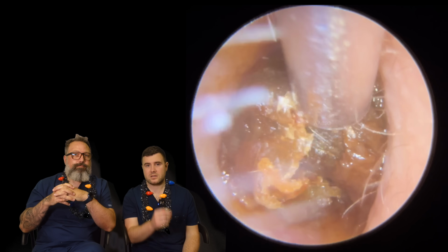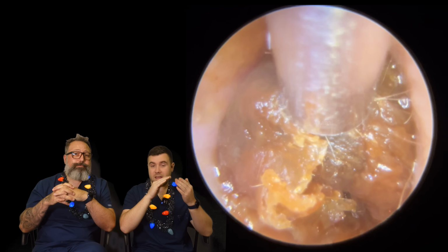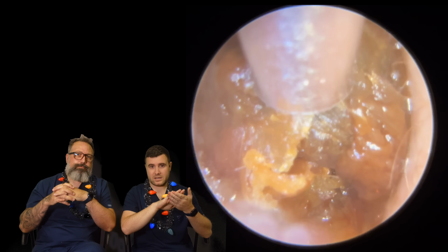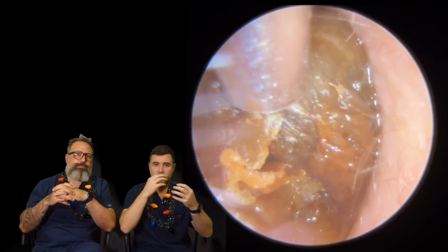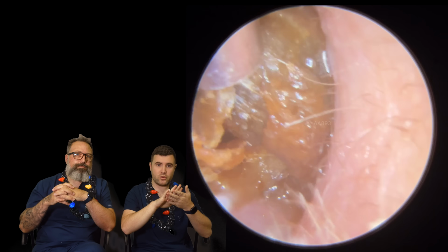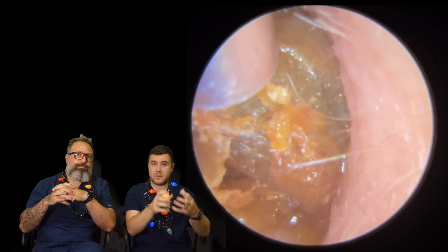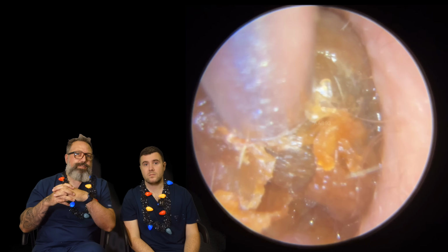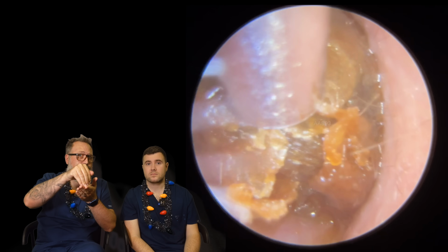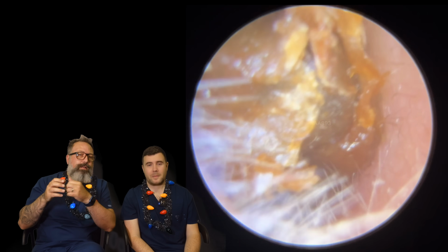You'll sometimes see us propping the Zollner tube against the wax and not really moving anywhere, because what happens then is we build up the pressure, build up the suction, we get a good grip, and that pressure slowly builds up and we're able to pull it a little bit better. You can see it almost looks like a bit of a cocoon, doesn't it? It's really solid. You can also use the edge of the Zollner tube just to chip and roll it down the canal.